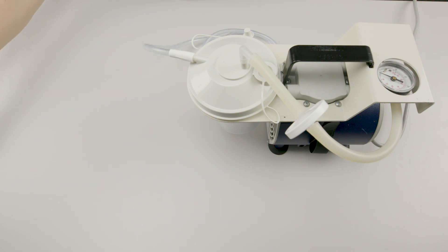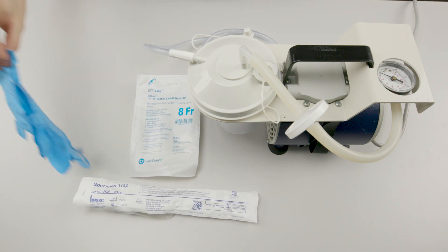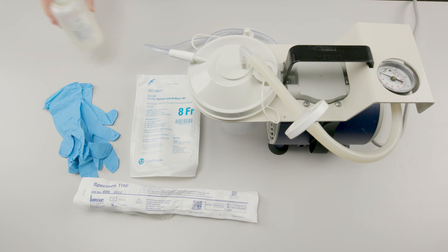You'll need an assembled suction machine, a mucus specimen trap, an appropriate size sterile suction catheter kit with gloves, non-sterile gloves, and sterile water. Do not use sterile saline.